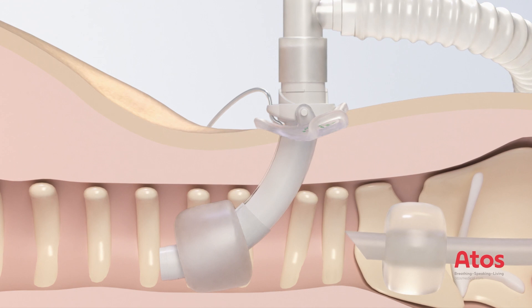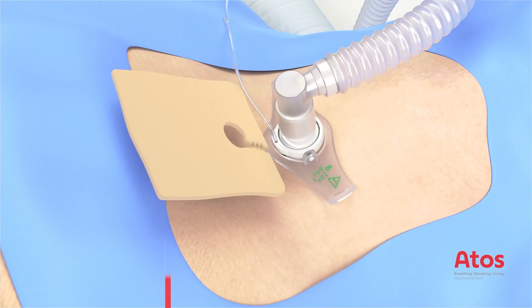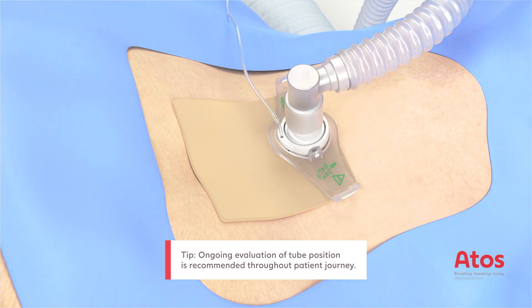The cuff of the ET tube is then deflated, withdrawn and removed under control of the anatomical structures. The ventilation parameters must then be adjusted. Place a dressing under the neck flange and fix the tube in place with the neck strap.